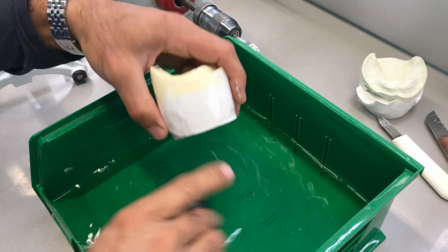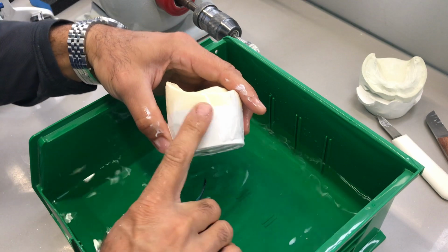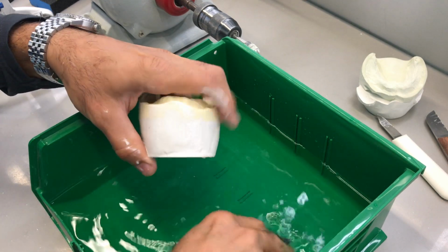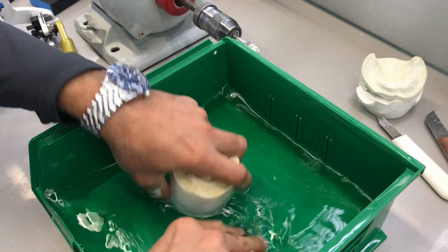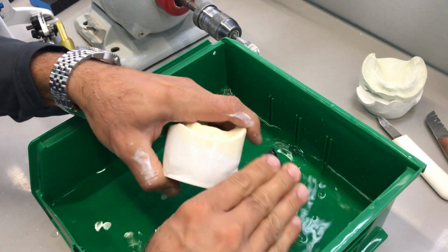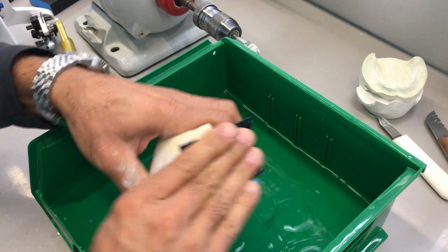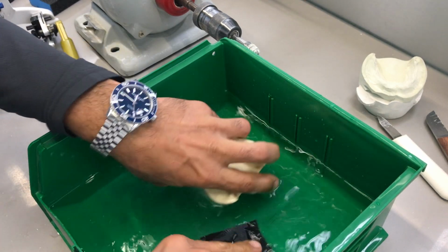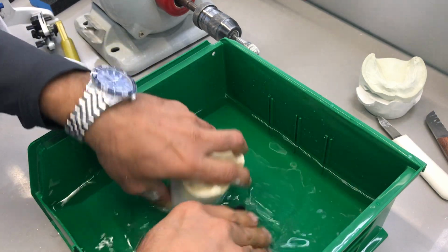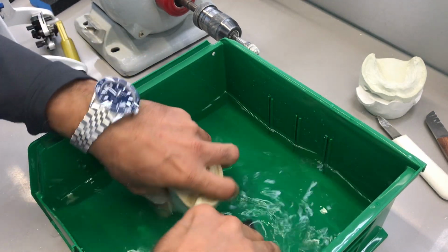So now this becomes very smooth. And it creates a nice visual where the model meets the mounting. So I'm going to do that all around. Once again, you would do this over a sink, over a tap, under running water. I'll continue all the way around, and it's very important, where you have your keyways, especially on the lower, that we have the external keyways, that we have a nice smooth finish. So I'm sanding a little bit the sides of the model, but not a lot. You can't do this unless your plaster has thoroughly set.